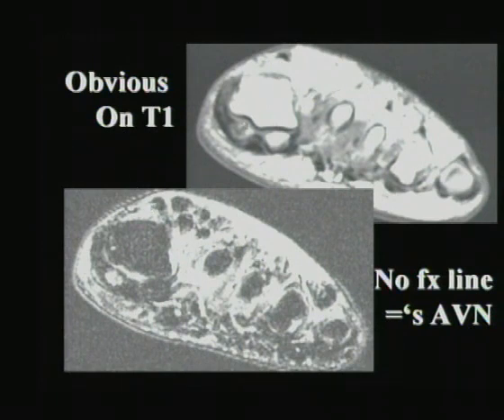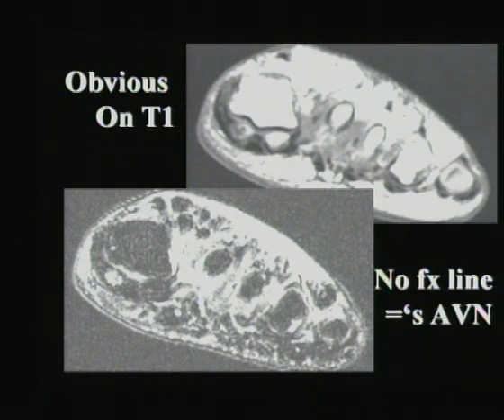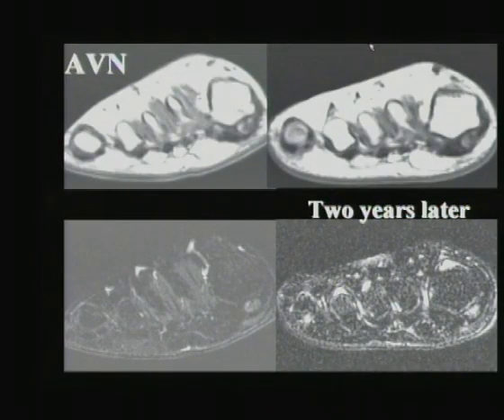In another patient, the tibial sesamoid is involved; the fibular sesamoid is normal. This is overt on T1-weighted imaging. It doesn't matter what it looks like on T2 — what matters is that something is wrong with it on T2. The more overt it is on T1, the more likely it is to be necrosis.